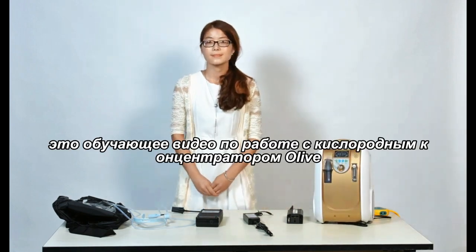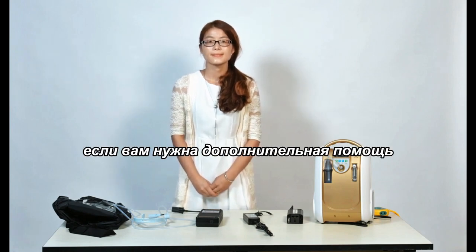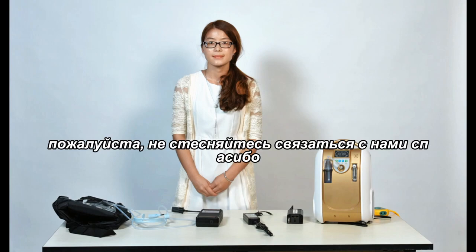This has been the Olive Oxygen Concentrator training video. I appreciate your time. If you need any further assistance or have any questions regarding this portable oxygen concentrator, please feel free to contact us. Thank you.